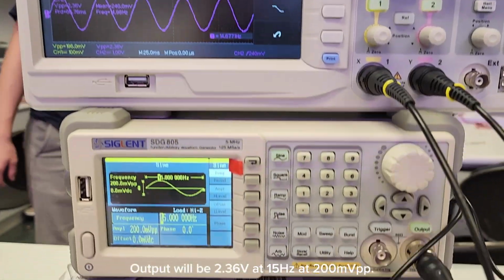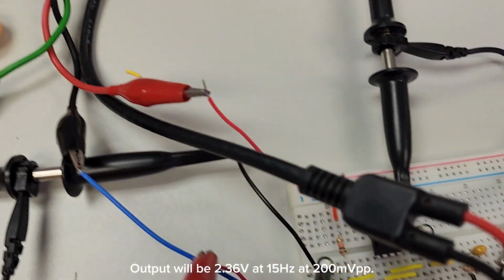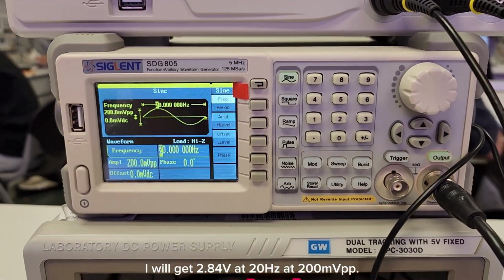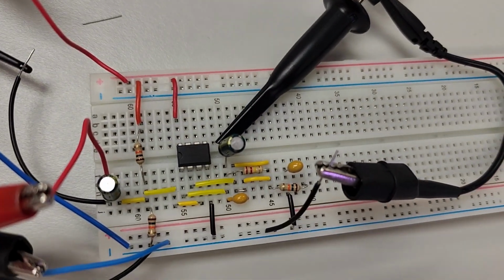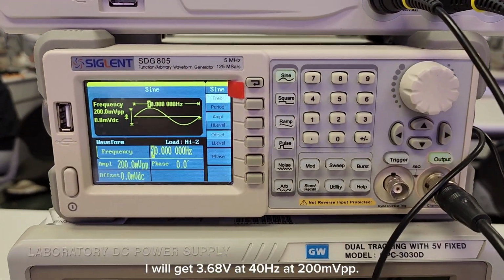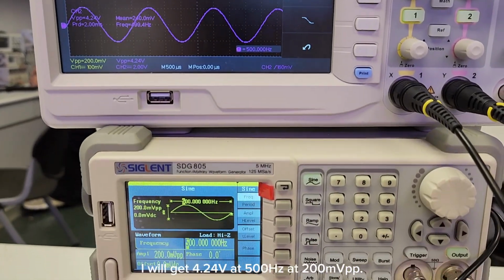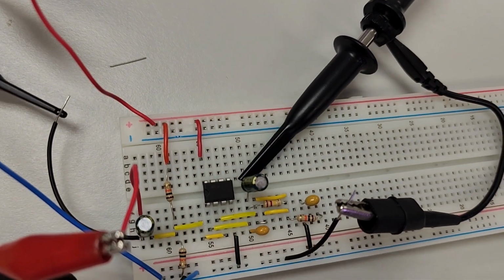Output will be 2.36 volts at 15 Hz at 200 mV peak to peak. I'll get 2.84 volts at 20 Hz at 200 mV peak to peak. I'll get 3.68 volts at 40 Hz at 200 mV peak to peak. I'll get 4.24 volts at 500 Hz at 200 mV peak to peak.